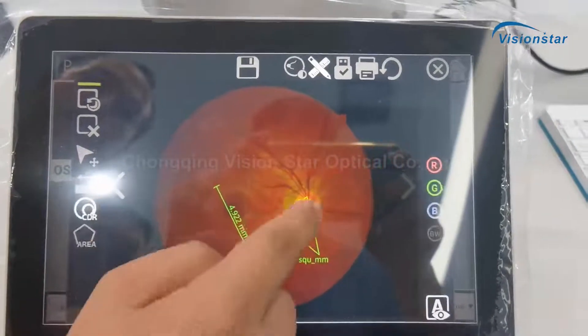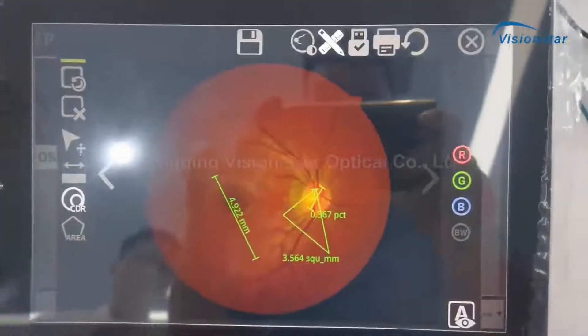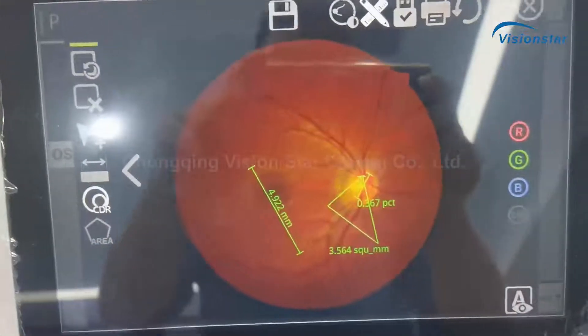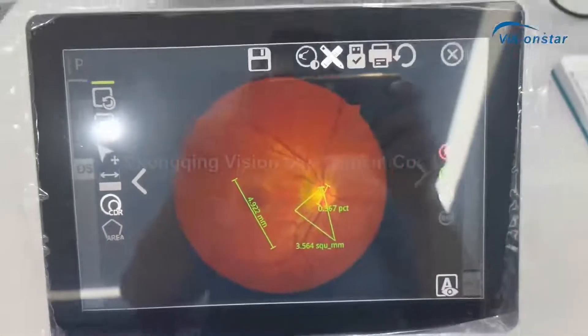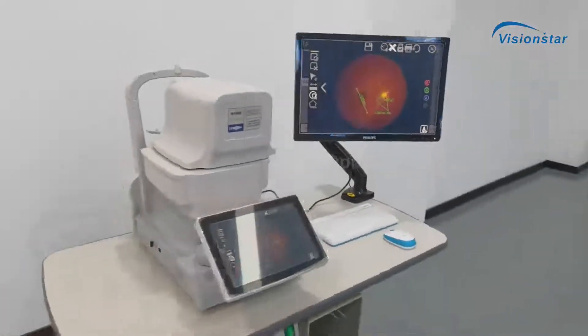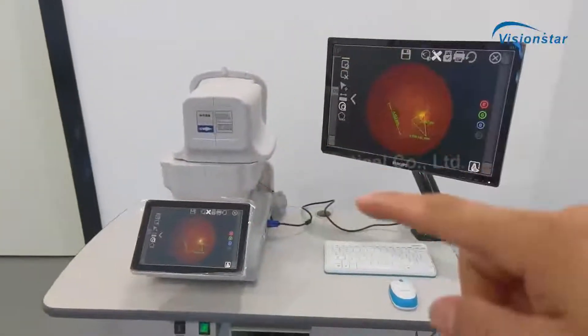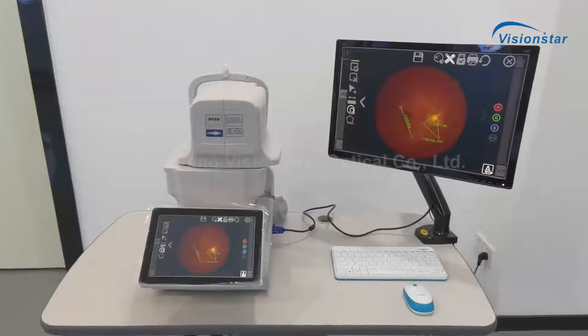You can also measure the distance and area, and calculate the disc — the optic disc. This is the finish. The device is not big and the operation is very easy.